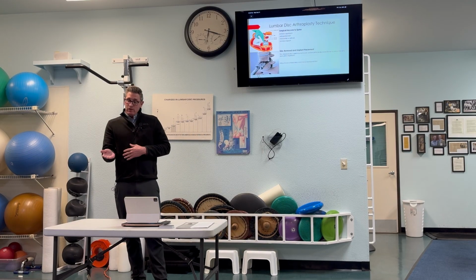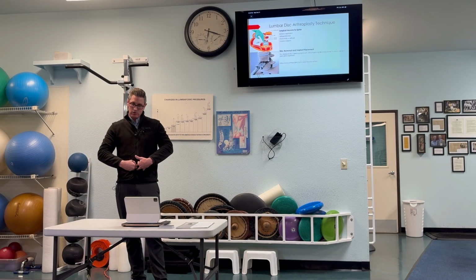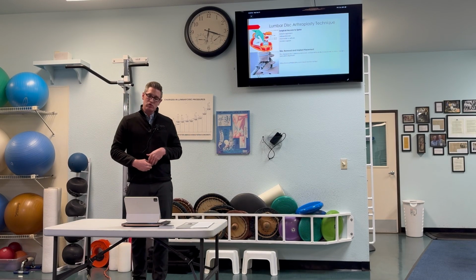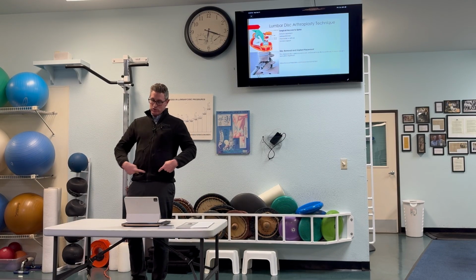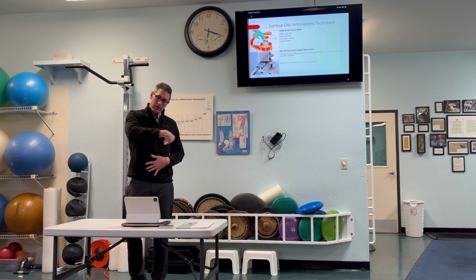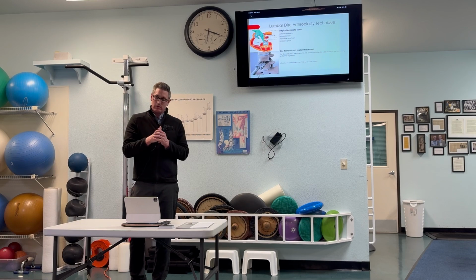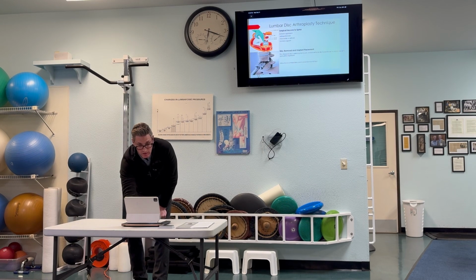From a technique perspective, relatively similar to a lumbar spinal fusion, particularly from an anterior approach. So lumbar disc arthroplasties have to be approached anteriorly. That's the only way that it's done currently, through what's called retroperitoneal. So an incision from the front of the belly, either that can be vertical or transverse, going down to the spine, retroperitoneal, behind the peritoneum, which houses the intestinal contents, and then access to the spine itself.